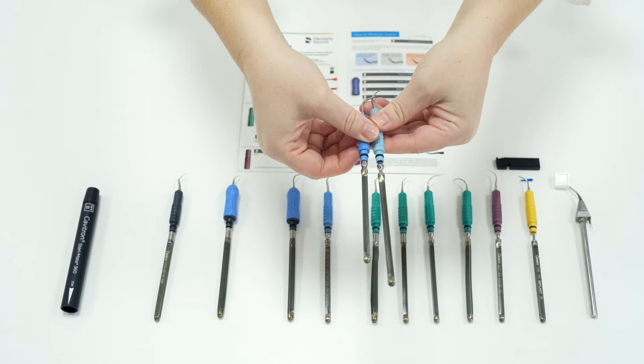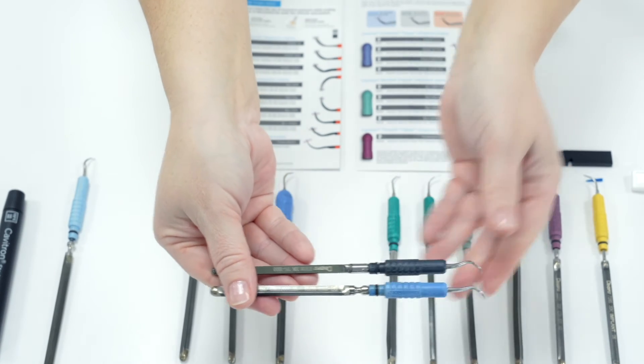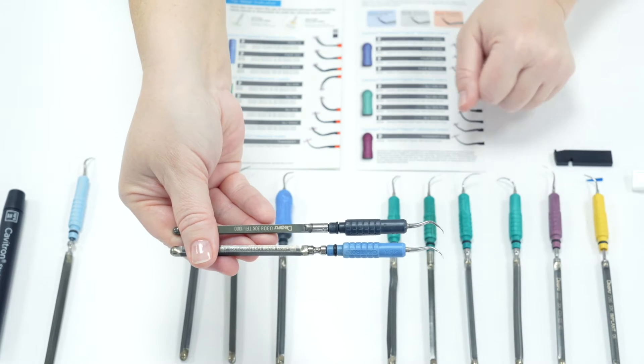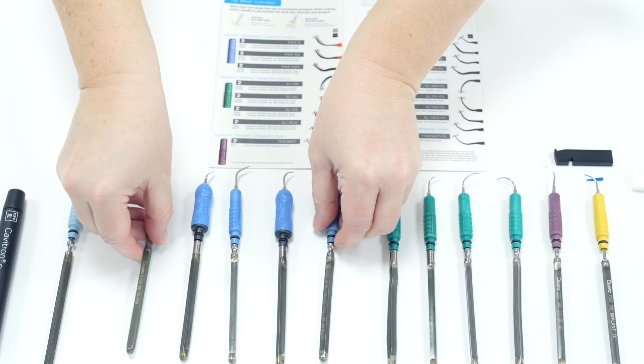You will still see the occasional insert with black or grey handles. This insert is called a TFI insert, which means through spray. The difference between a TFI through spray and an FSI focus spray insert is where the water comes out. On a through spray insert the water comes out close to the handle and tries to hit the tip to cool it down, whereas the focus spray tip has the water coming out close to the tip, cooling it more efficiently and preventing it wearing out too quickly. If you come across TFI black or grey inserts they will be very old and should be discarded.